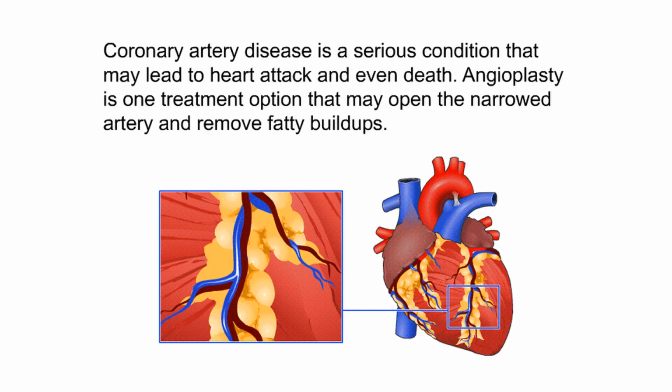Summary. Coronary artery disease is a serious condition that may lead to heart attack and even death. Angioplasty is one treatment option that may open the narrowed artery and remove fatty buildups.